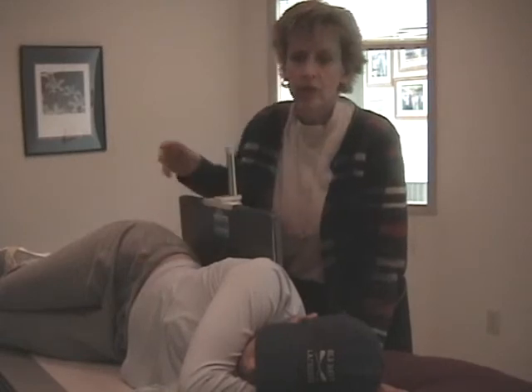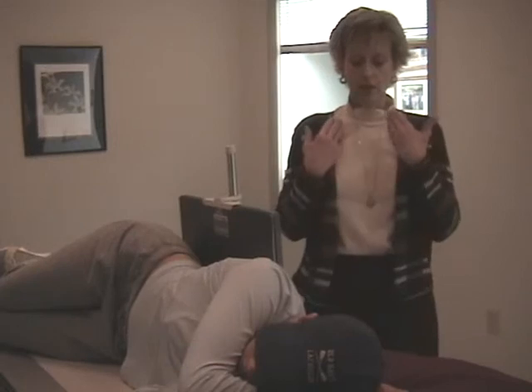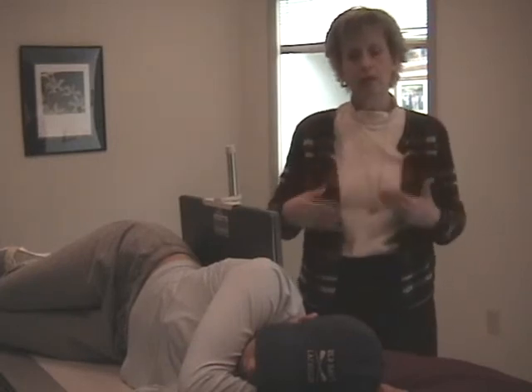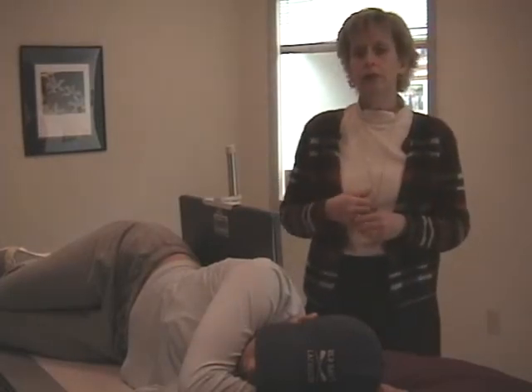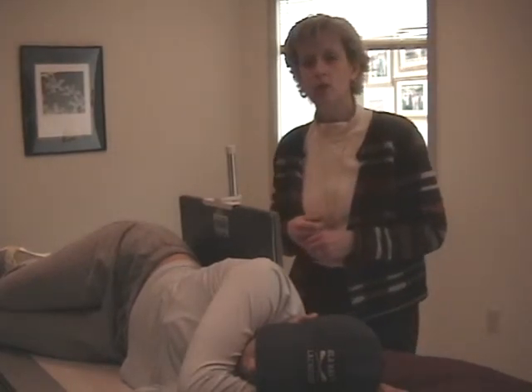In an upright position, you may need more mAs because when the patient stands up, the tissue tends to go like this, becoming denser. You want to pay attention to your post-exposure readout so you do know how much mAs is being used on these.